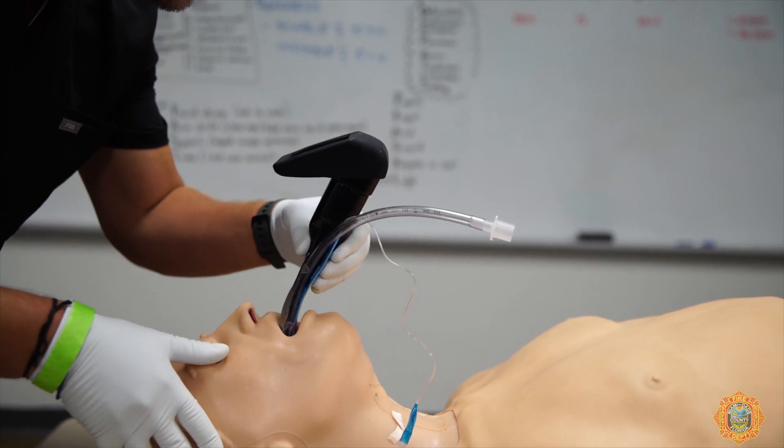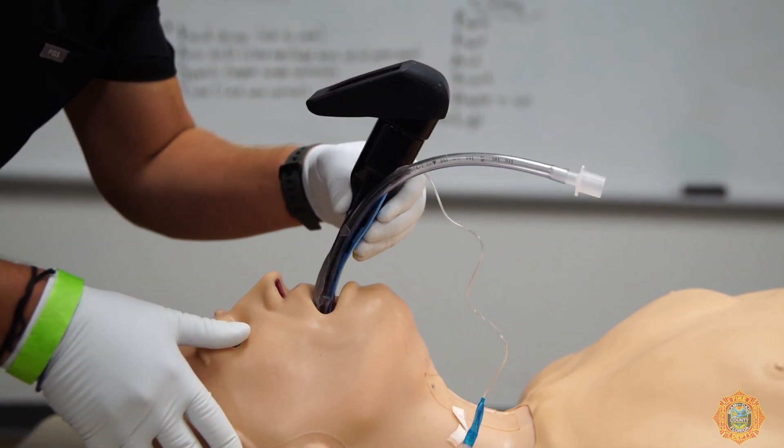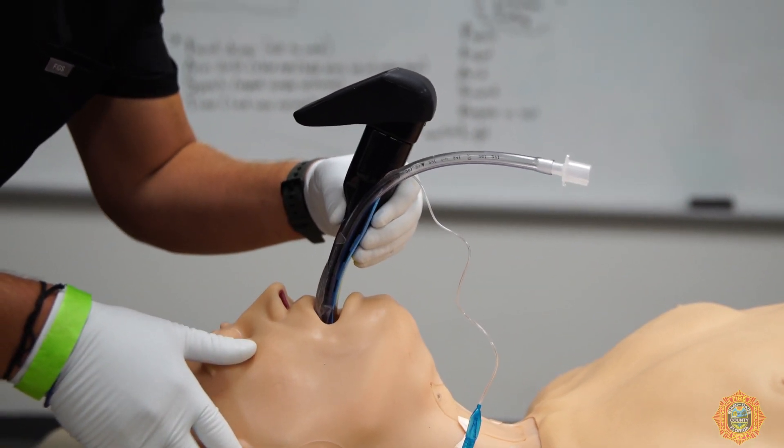Continue the insertion until the epiglottis is identified. Place the tip of the AirTrack SP in the vallecula. Gently lift the AirTrack SP to expose the vocal cords. Align the vocal cords in the center of the visual field by gently moving the tip of the AirTrack SP as necessary, either left or right.